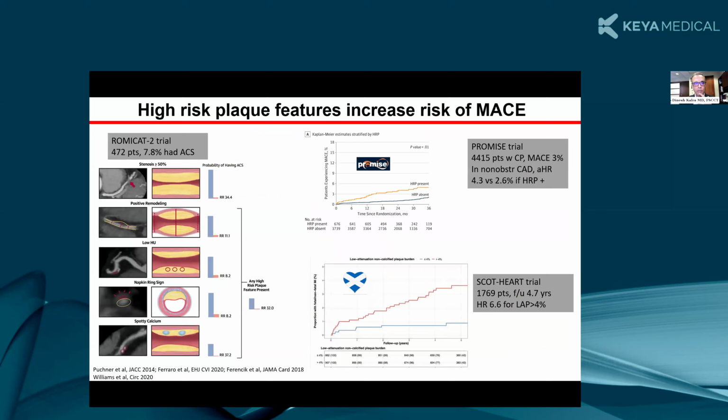And so you now know that this gentleman has 3-vessel diffuse plaque. And as we've heard, that has an independent prognostic value. In fact, in two of the trials, PROMISE and SCOT-HEART, the presence of non-calcified plaque, which is felt to be the more unstable plaque, had a hazard ratio of about 4 to 6-fold in short to medium term MACE events.